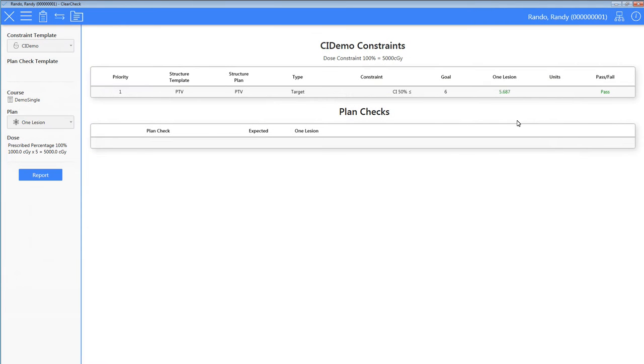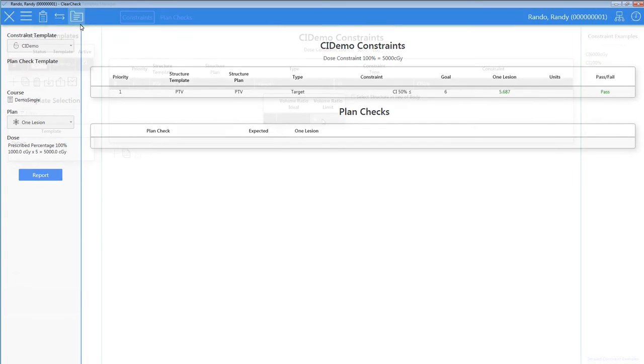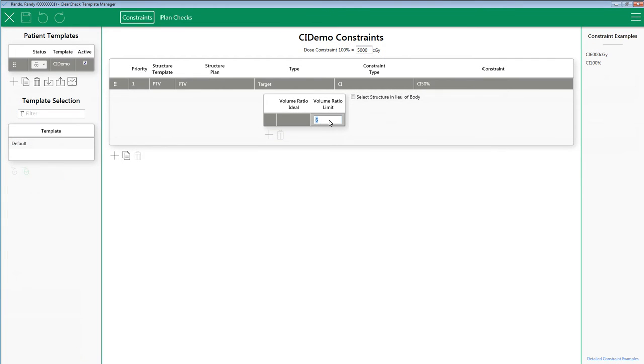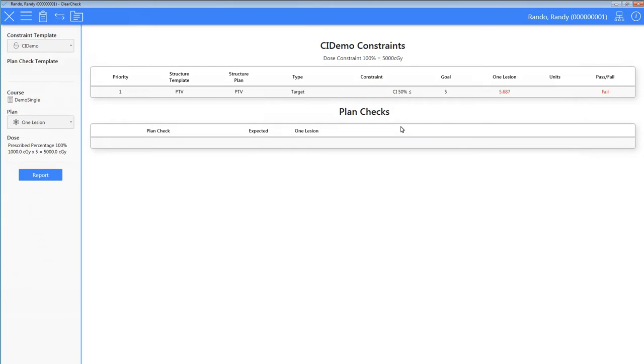For the single SBRT plan, the conformity index is 5.687. So it passed. If I drop the limit lower, say 5, it will fail.